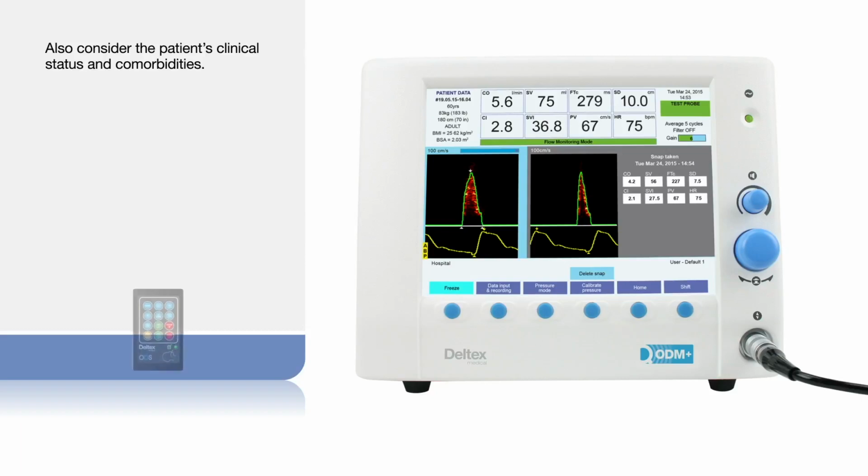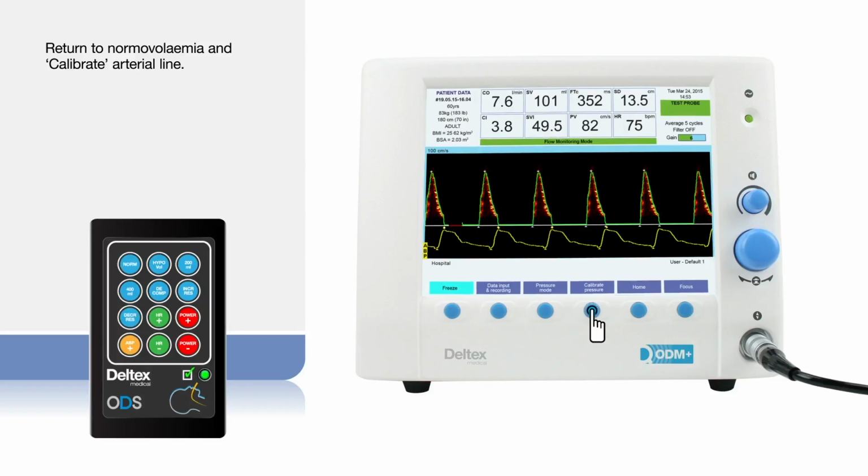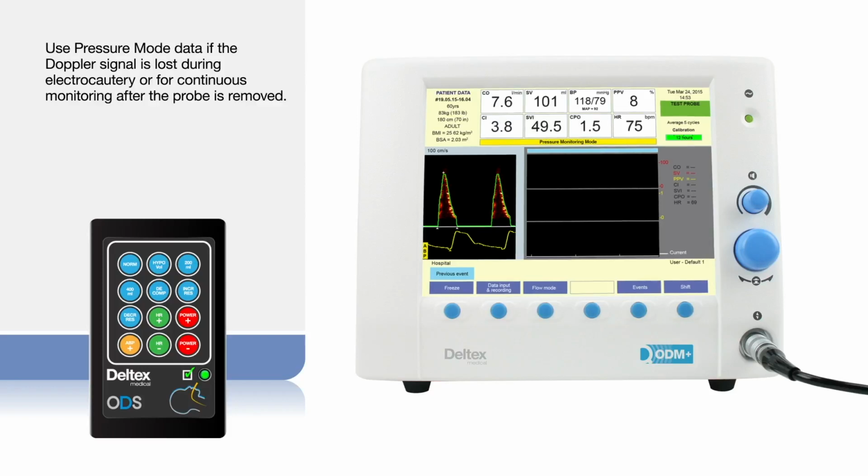Let's change back to normovolemia and initialize data from the arterial line. Simply press Calibrate Pressure. This calibrates pressure against the precise measurement of Doppler blood flow. Derived data can be used in pressure mode should the Doppler signal be lost due to diathermy or during continuous monitoring after the probe has been removed. If you toggle between flow mode and pressure mode, you can see that the data are consistent.